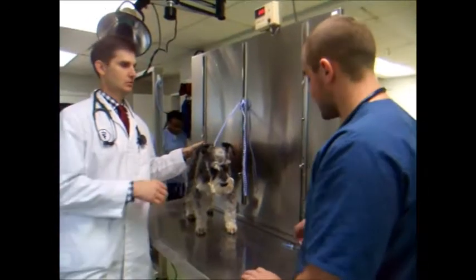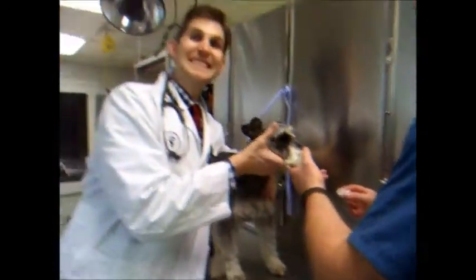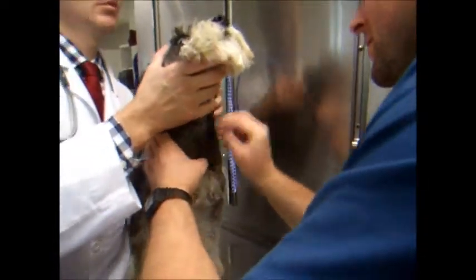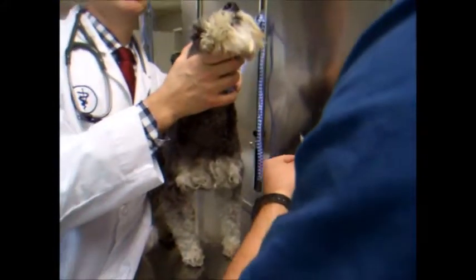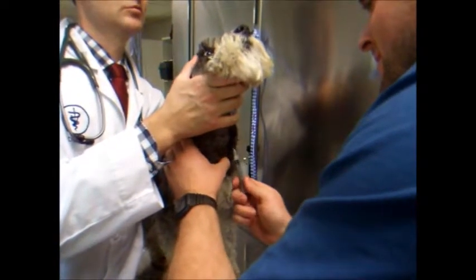I'm going to go ahead and demonstrate how to draw blood from the jugular vein on a dog. Dr. Burke is going to assist me here. Use some alcohol to sterilize the area. Alcohol is always good. Just like jugular.